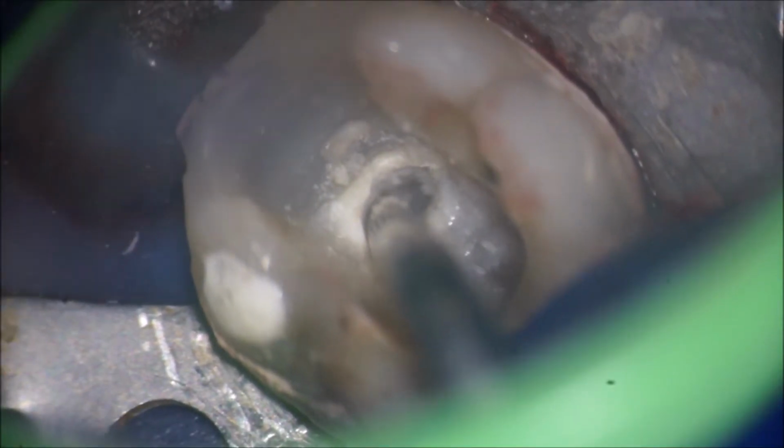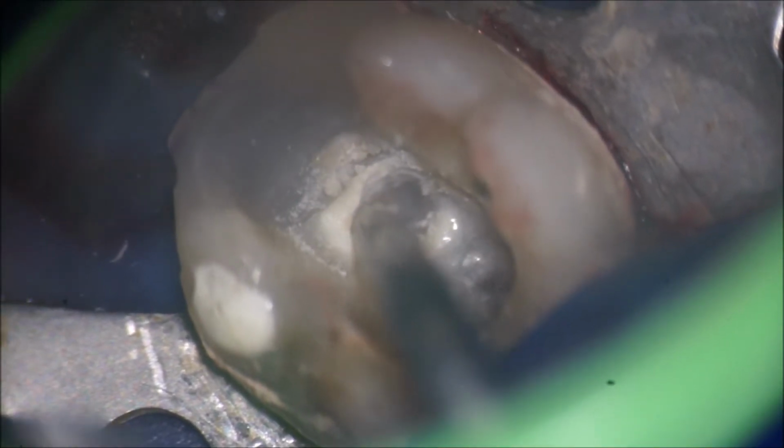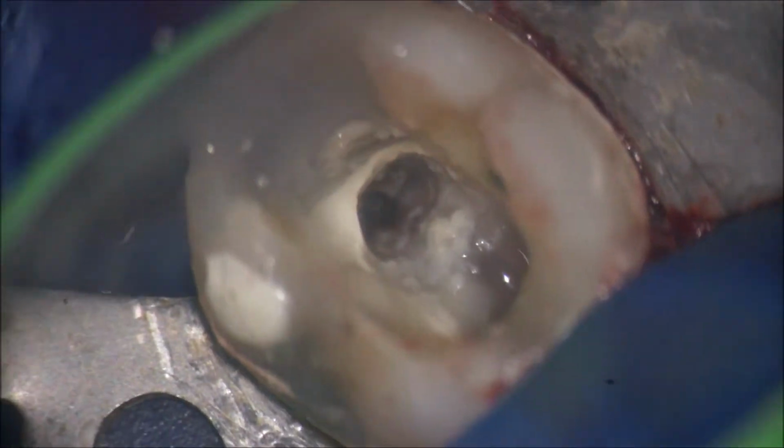Startex number 2 to open up the orifice a bit further in an attempt to get all the pulpal tissue out of there. It was a very fibrous tissue. It was also, think of it as dentin flakes in there. Not sure why it formed. I would have expected the resorptive lesion to be without any calcified tissue, but this one had some in it.